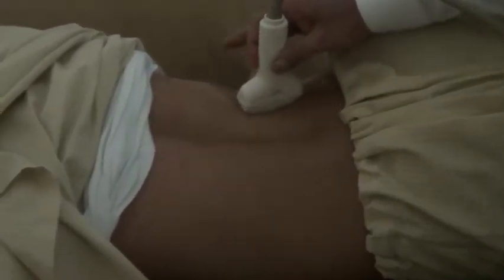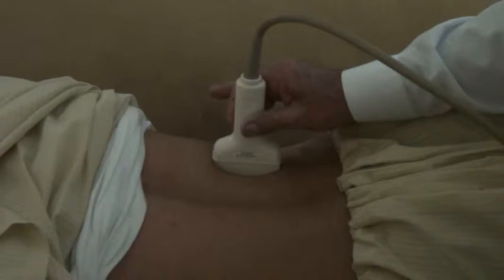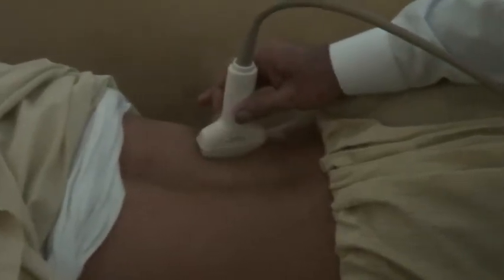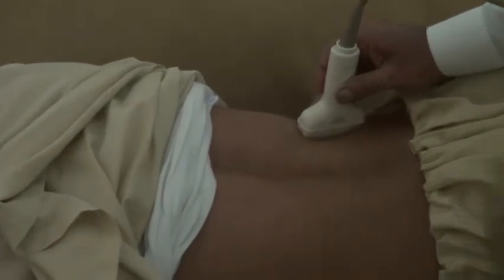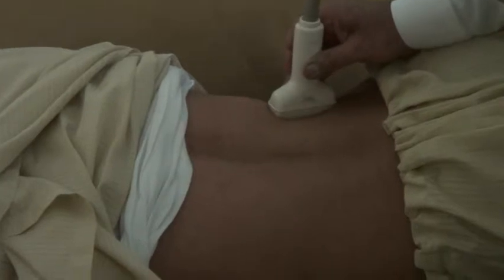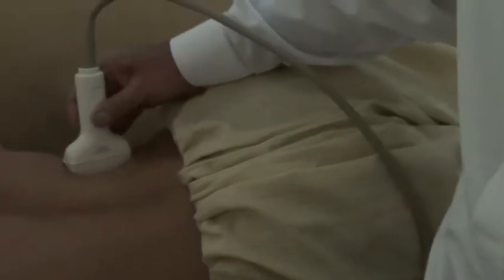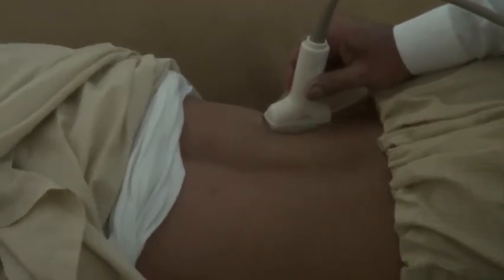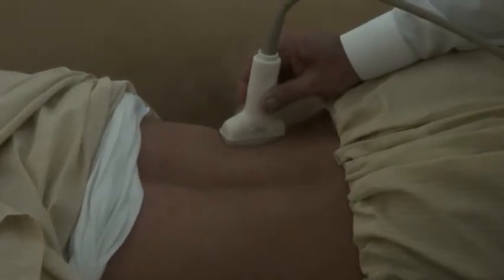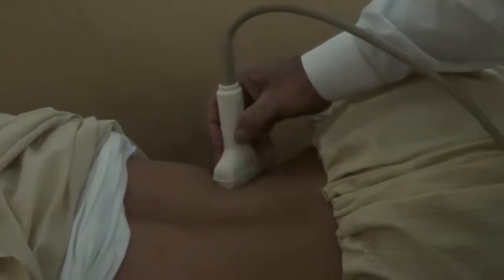Now, there will be some angling. If you do not get the kidney in this perpendicular plane, you will have to angle the probe a bit to get the kidney in total. And as this will vary from patient to patient, you should remember what is essential. Here you will get the kidney in this region, and you will angle the probe laterally to get the kidney in total. Similarly, from here, where you are getting the kidney in total, you give the probe a 90-degree sweep, and you will get the transverse section of the kidney.